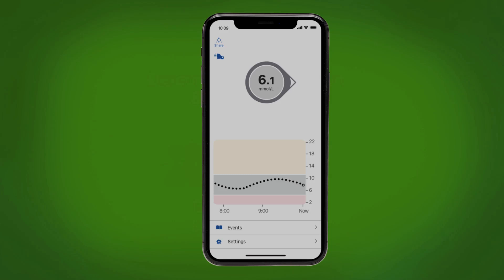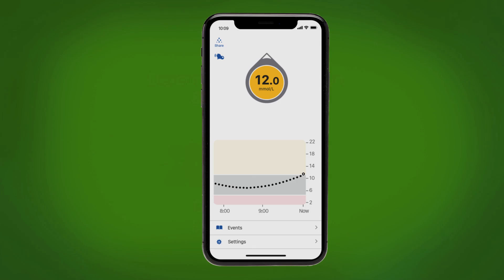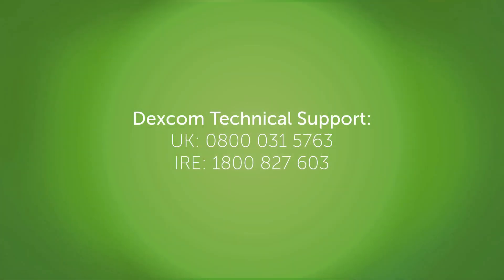See that number in the gray circle? That's an example of a sensor glucose in target range. It updates every five minutes. Over time, your graph fills in. When you go below your low alert setting, the app alerts you and the circle turns red. When you go above your high alert setting, the app alerts you and the circle turns yellow. Of course, if you have any questions during setup or any other time, call Dexcom Technical Support.